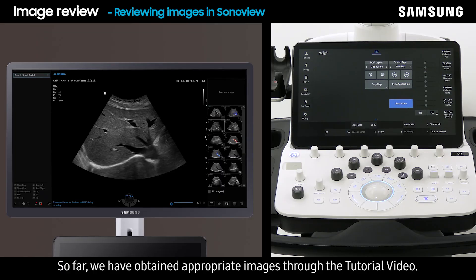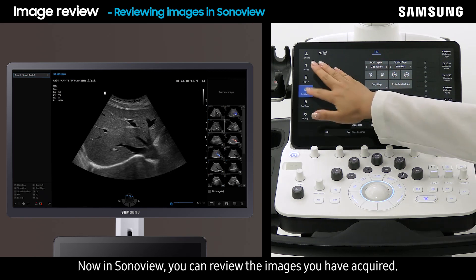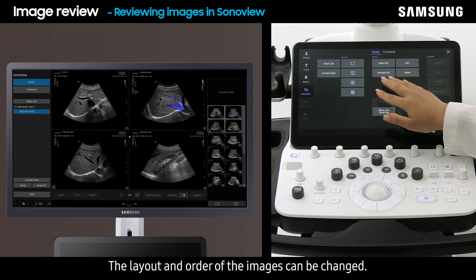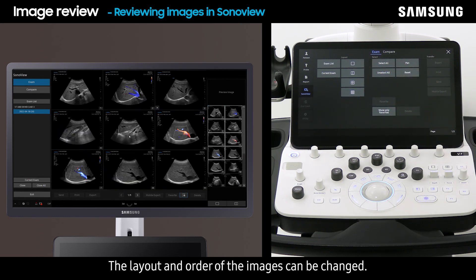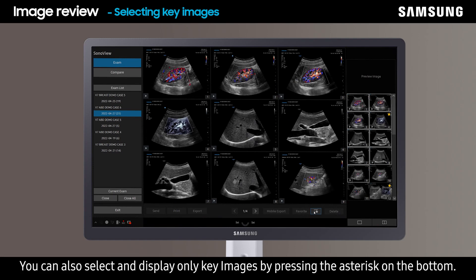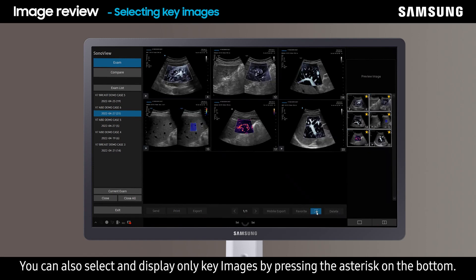We have now obtained appropriate images through the tutorial video. In SonoView, you can review the images you have acquired. The layout and order of the images can be changed. You can also select and display only key images by pressing the asterisk on the bottom.